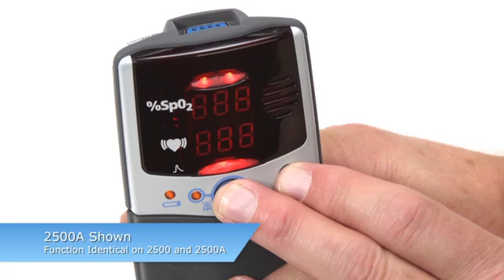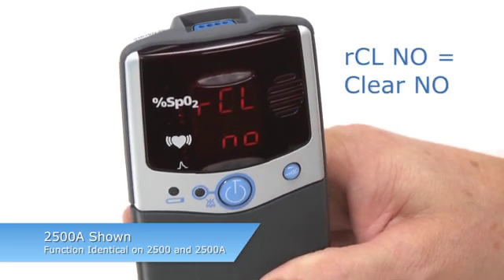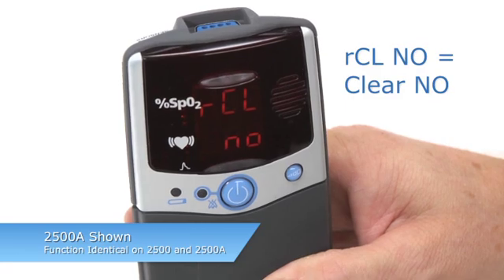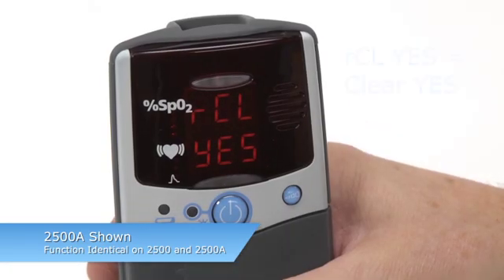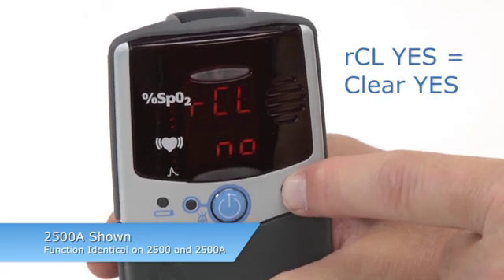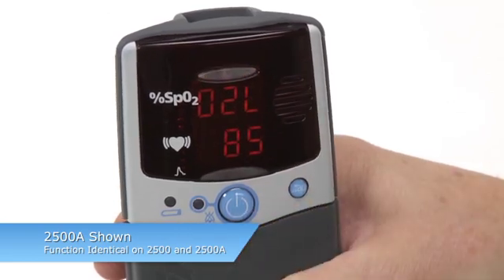A series of 3 8's will appear in the pulse rate and SpO2 areas, and the clock time will briefly appear, followed by RCL NO. This allows you to retain the memory on the oximeter or clear it. To clear memory, press the ADVANCE key until you see CLEAR YES, then press the ON-OFF key to perform that memory function.